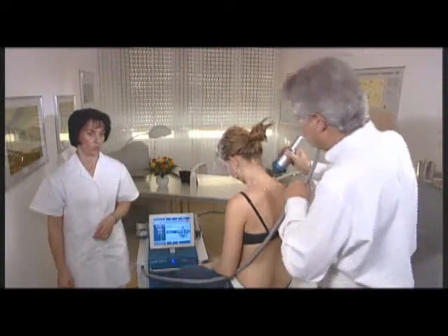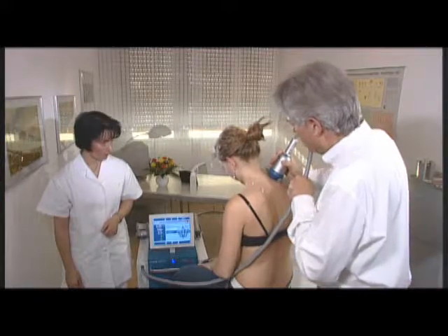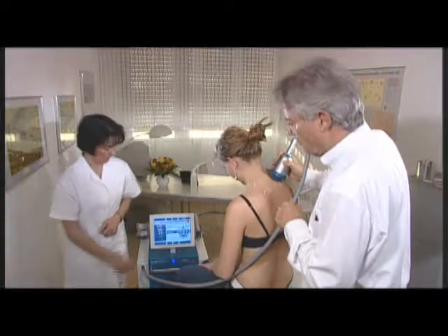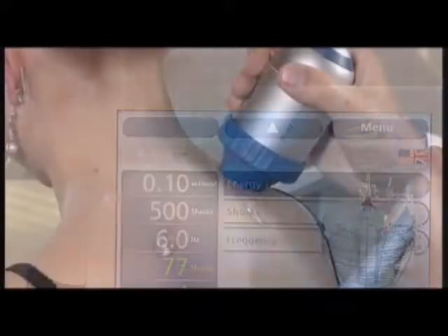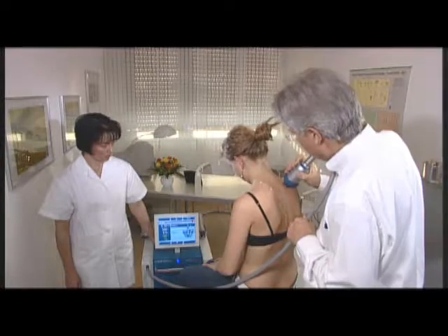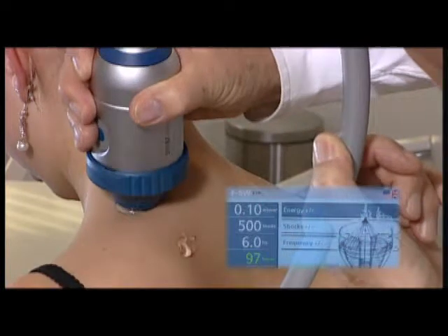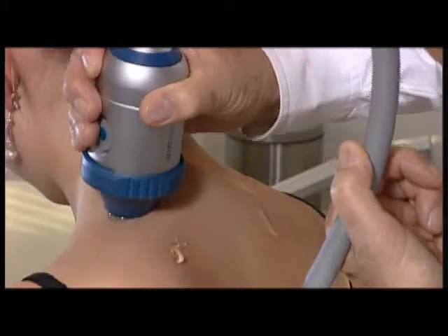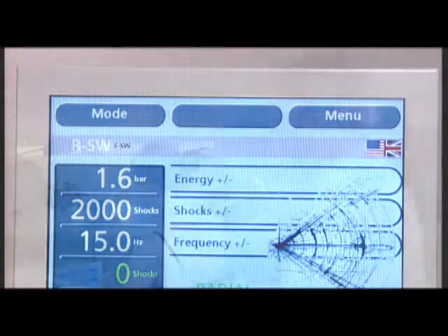Wir suchen jetzt. The diagnosis by palpation reveals extremely hardened muscles at the cervicodorsal junction, in the trapezoidal and the interscapular region, and in the shoulder. The painful trigger points are palpated actively on the basis of the patient's feedback. Precise localization is then performed by means of focused shockwaves. Radial pressure wave therapy is conducted according to the principles of low-energy trigger point treatment, using 2000 pulses per session.